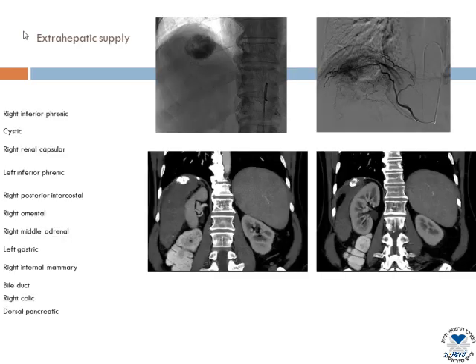In large tumors, what you have to look for is extrahepatic supply. Often, if you do an angiogram on a large tumor, you will not see all of it because of some recruitment of blood from the surrounding vessels. And on the left, in descending order, you can see the most prominent vessels supplying tumors in the periphery of the liver, as you can see on the image below, on a tumor in the liver dome that is also invading the capsule and abutting the diaphragm. So this patient was also treated with inferior phrenic embolization.